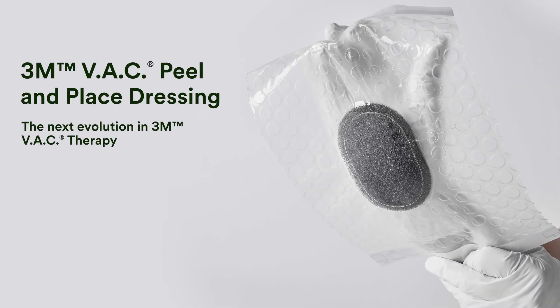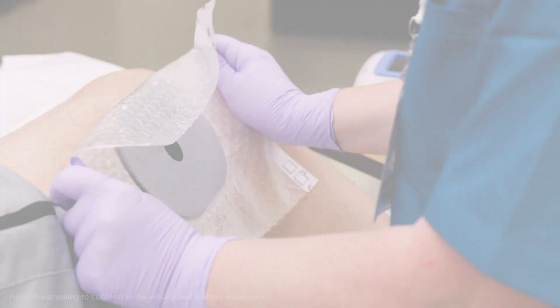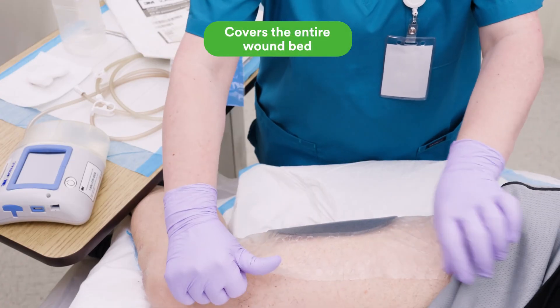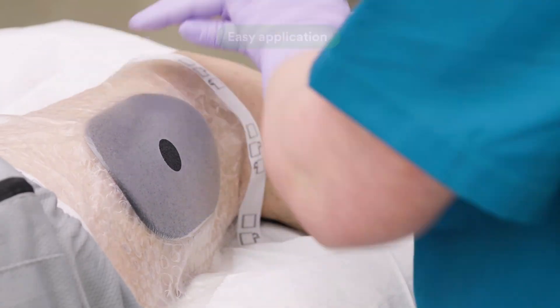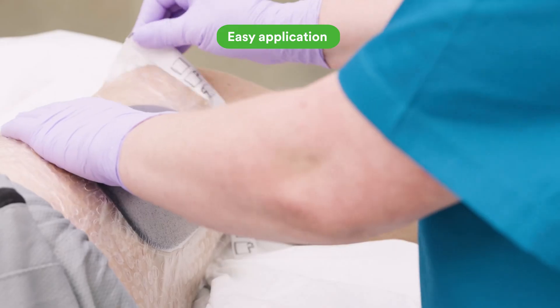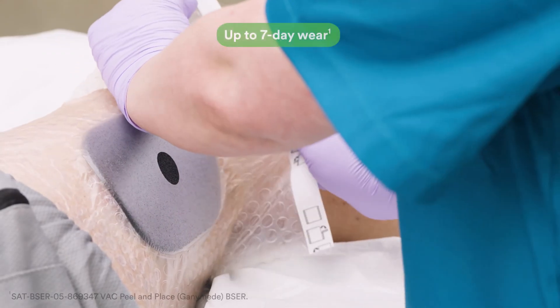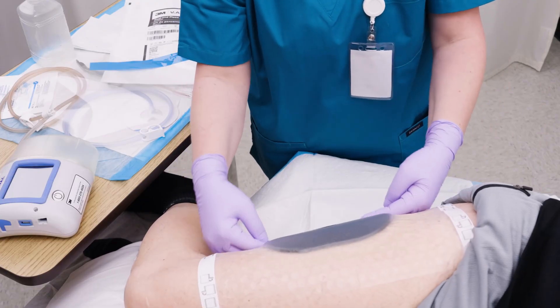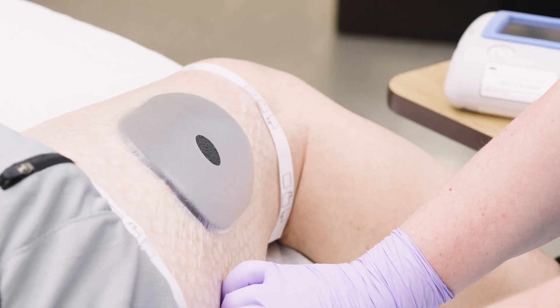3M VAC Peel-in-Place Dressing is the next evolution in 3M VAC therapy. It is an all-in-one dressing designed to cover the entire wound bed and surrounding peri-wound skin for easy and time-saving application. It is safe to wear continuously for up to seven days, creating an environment that promotes wound healing and potentially requires fewer dressing changes.